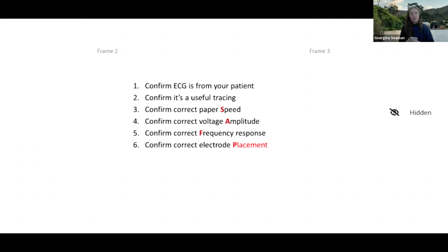Fine VF, absolutely. So obviously sometimes when we look at our ECG, it looks all perfect and nice, and we can see all of the things that we need to look at from our waves and segments. But sometimes, for example, if someone has quite a large chest, or as Zoe's alluded to, a large amount of adipose tissue, our amplitude can't be seen as much. So we might have smaller spikes on the ECG waveform, and we can't actually see those waves very well.